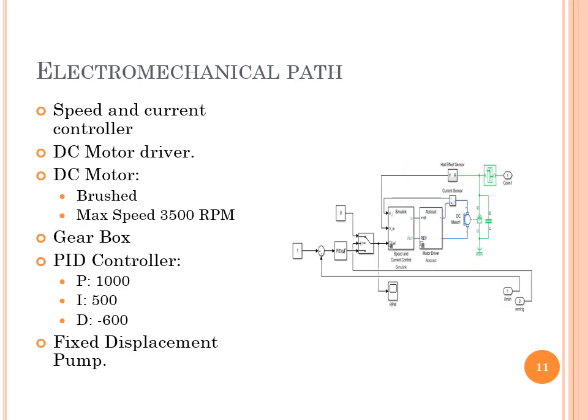In a physical machine, the electromechanical path is located inside the machine. Its main component is the DC motor with its controller circuit. For simplification purposes, some of the small and non-critical components are not represented in this video, since they don't directly affect the outcome of the design. The main components are the PID controller. For the flow control, it takes feedback from the flow sensor and controls the motor speed to achieve a constant speed.